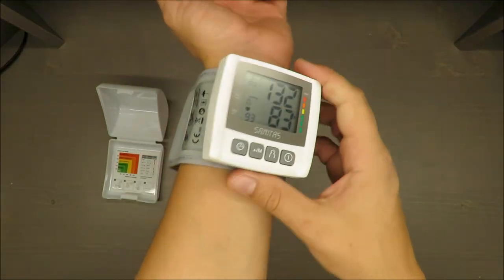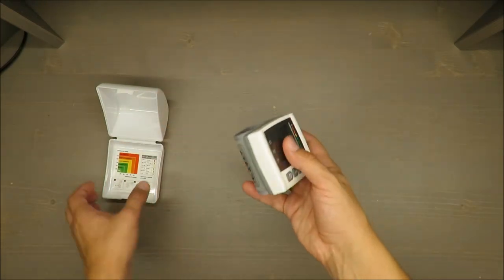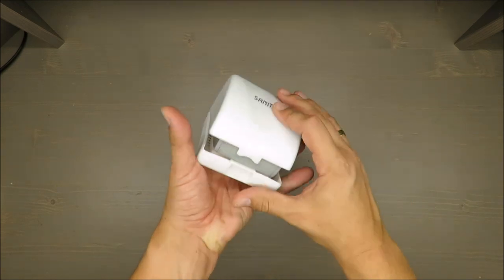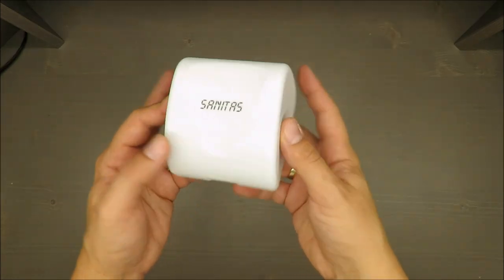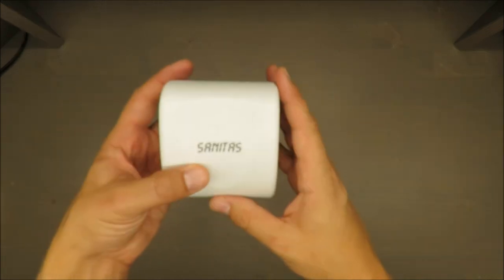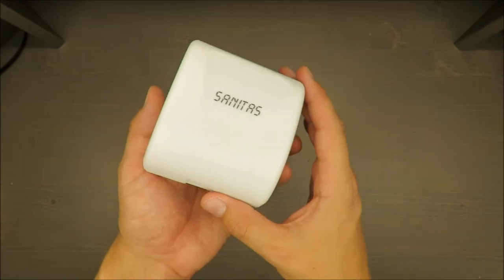One of the biggest — or the best — features in my opinion is the size. It's very compact, as you can see. You can easily take it with you in your belongings if you need. I think it's quite a nice design.